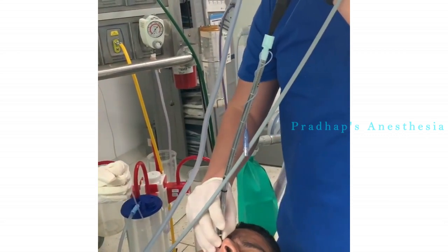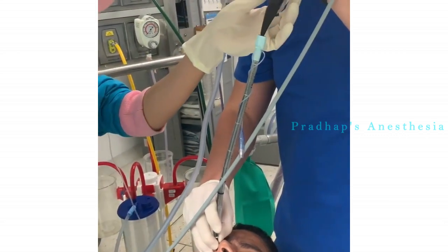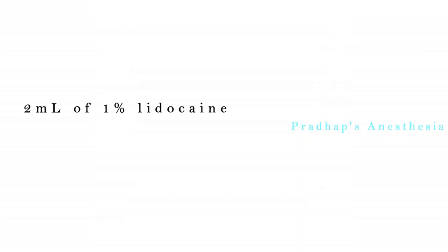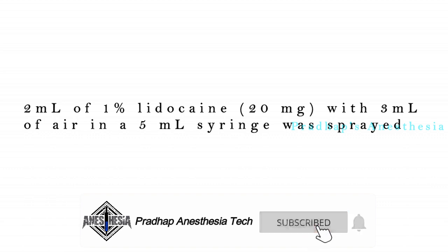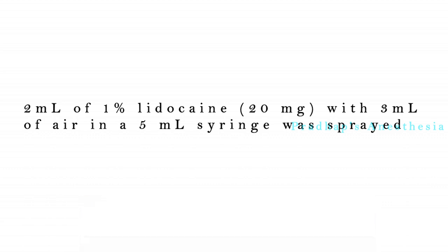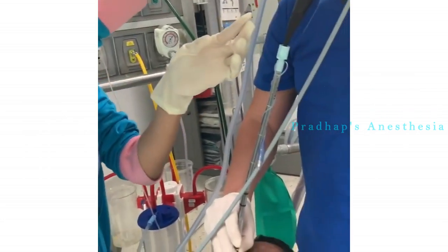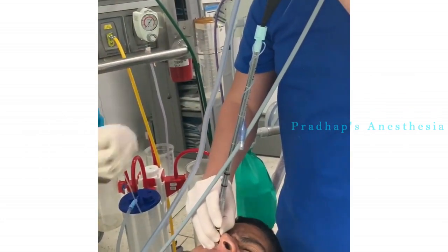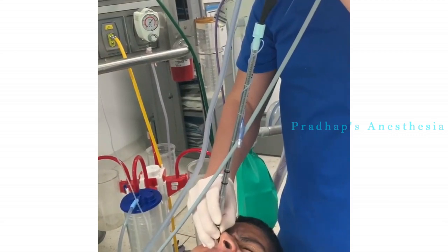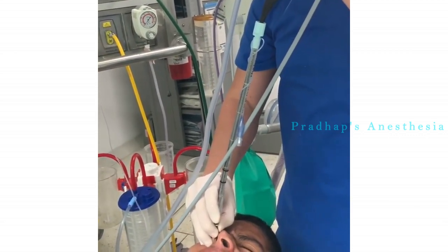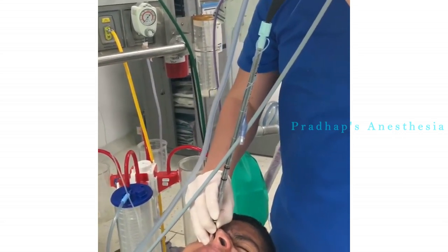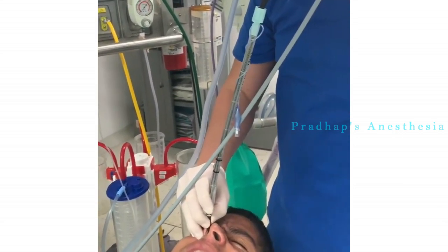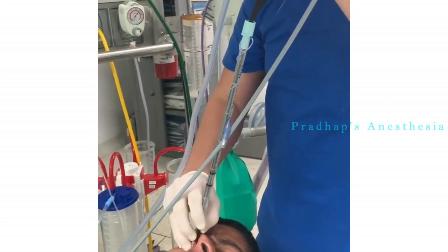A fiber optic scope was advanced through the nasotracheal tube, and 2 milliliters of 1% lidocaine (20 milligrams) with 3 milliliters of air in a 5-milliliter syringe was first sprayed onto the epiglottis via the working channel of the fibroscope. The fibroscope was then advanced toward the glottis and passed behind the epiglottis to visualize the vocal cords. A second dose of 2 milliliters of 1% lidocaine (20 milligrams) was sprayed toward the vocal cords.